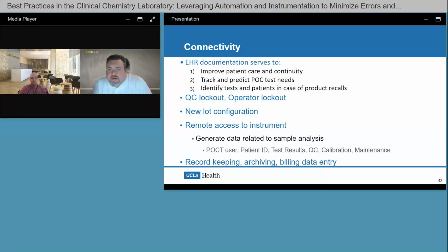If point of care testing is just as good as the testing we do in the lab, then do we need to do a better job of educating doctors that there's no need to confirm results by sending samples to the lab? Wouldn't this be unnecessary and fall under duplicate testing? Yeah, good question. First of all, if it's as good as the lab, again, I think there is that preconceived notion that point of care devices are smaller, and because they are smaller, they cannot be as good as the big instruments in the lab that measure the same analytes. They are smaller. They have come a long way, but they also measure fewer analytes than the big instrument in the lab that measures a few dozen or even close to 100 analytes, depending on how you have it reconfigured.